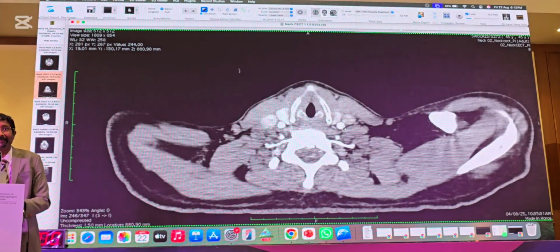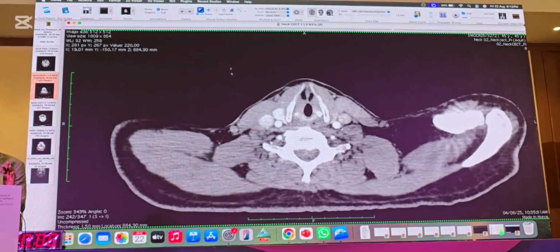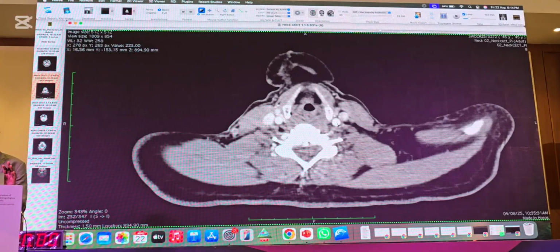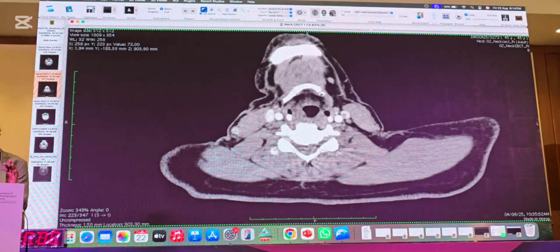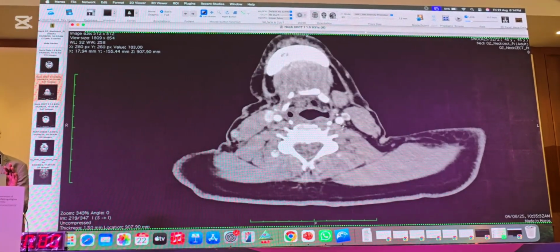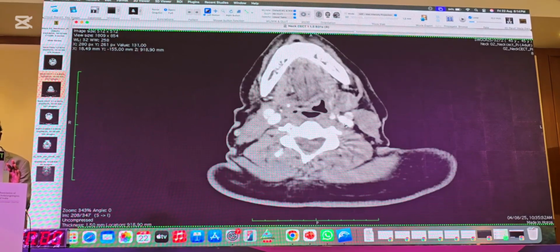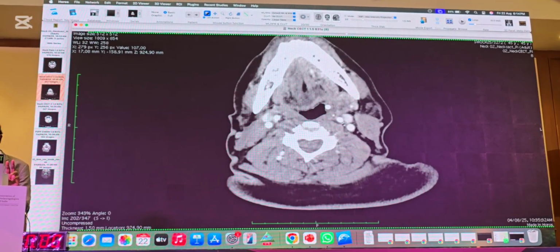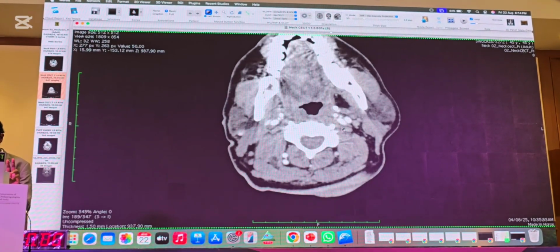So at what point does it bifurcate? Hyoid. Into internal and external. See that? Still it has not divided. Coming up. So now you have started seeing the hyoid. Still it is a similar structure. It's becoming flatter and dividing into two. Can you appreciate the division? So this is internal carotid and external carotid. Clear?